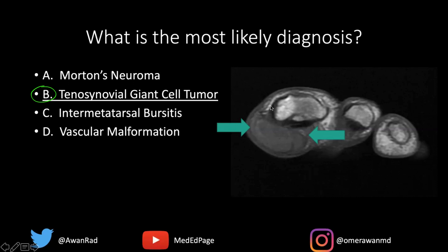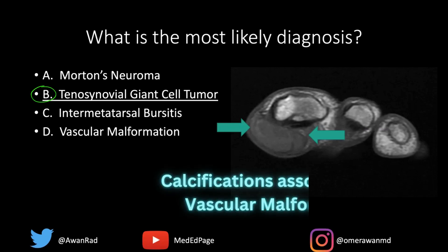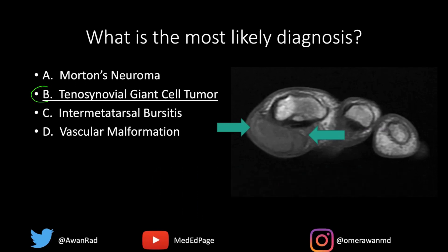Intermetatarsal bursitis is fluid also in the interspace, but it would be above — dorsal to — that intermetatarsal ligament, if you have fluid in the interspace. A vascular malformation would be a consideration, but oftentimes you can have calcifications or phleboliths associated with vascular malformations, which would be dark on MRI. We don't see that here.